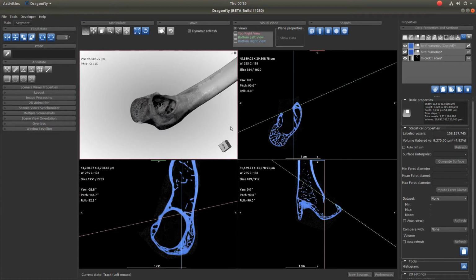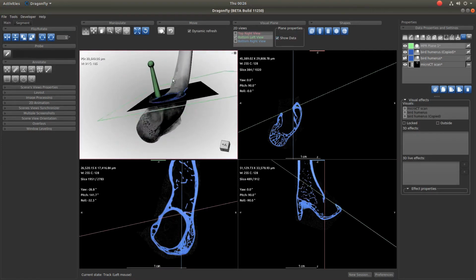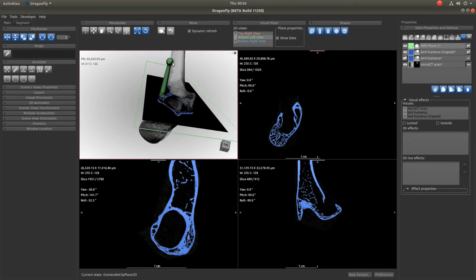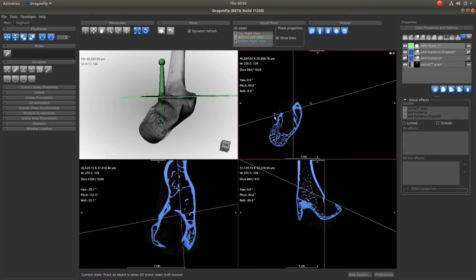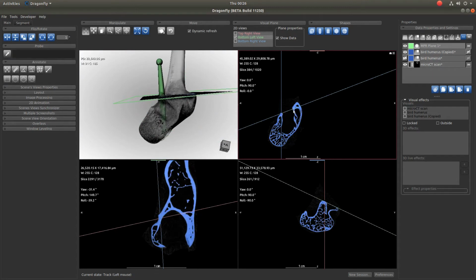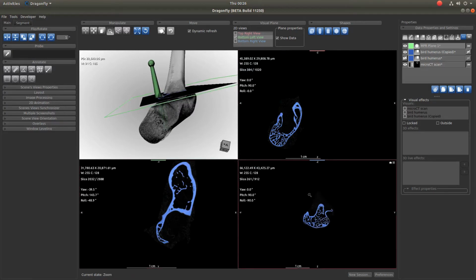If I take the bottom left view and plot it, and do a show data, you can see we've positioned it just about at the spot, and I can grab it and manually adjust it here if we want. This allows you to decide and interact and find the spot where we want to position that cap. Once we've placed it, we can use the manual segmentation tools. It looks like I accidentally tipped it in this other plane.